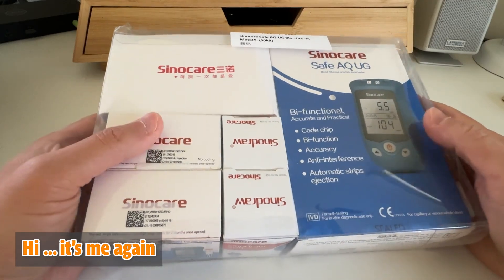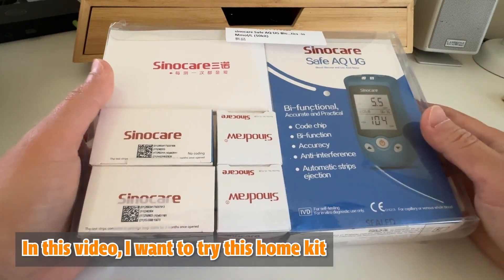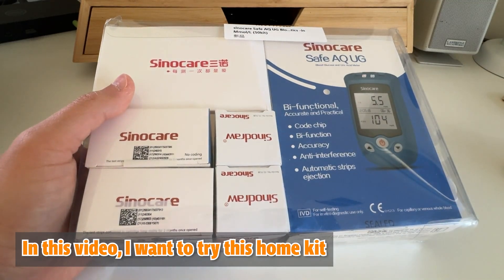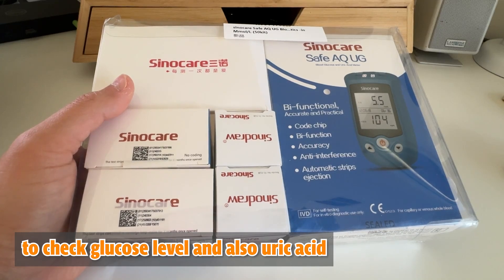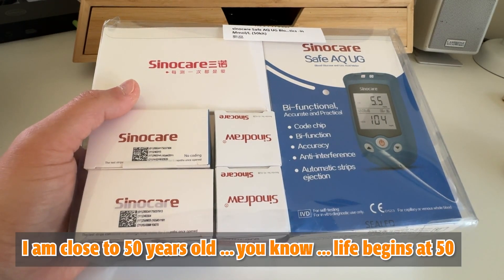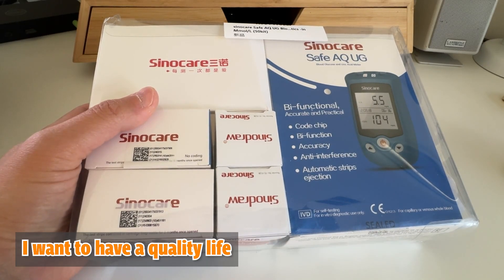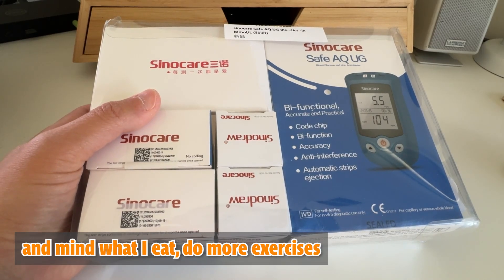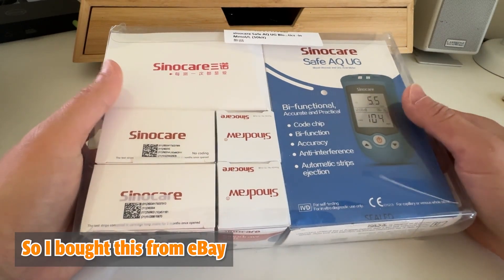Hi, it's me again. In this video I want to try this home kit to check glucose level and also uric acid in the blood system. I'm close to 50 years old — you know, life began at 50 — I want to have a quality life and mind what I eat and do more exercise, so I bought this from eBay.